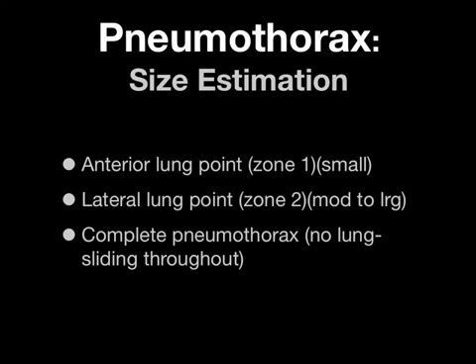So the more of these exams you do and the better you become at them, what you're going to want to do is scan in more slices in zone 1 and zone 2, and then in your own mind recreate where sliding was present and where it wasn't, and you're going to be able to then have a better 3D image of the size of that pneumothorax.